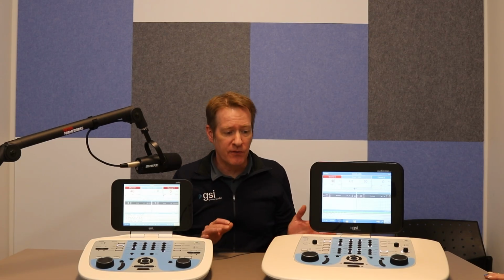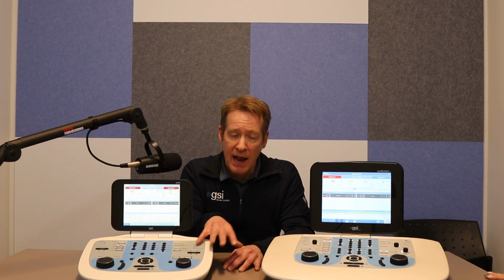The one last thing that I'm going to mention is the autoplay word limit. Now, the autoplay word limit is a new feature, and what this allows us to do is just set the number of words. So some of us may have like a 25-word list or a 50-word list or a custom number. With the config app, you can put a custom number in, but we have 10, 15, 25, and 50 that are in there, and you can just select any of those, and it will end after that number of presentations, which will save you from having to go, was that 25 words, and then stop it. So all at your fingertips with both AudioStar Pro and with Pello.